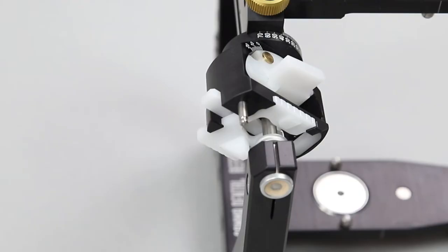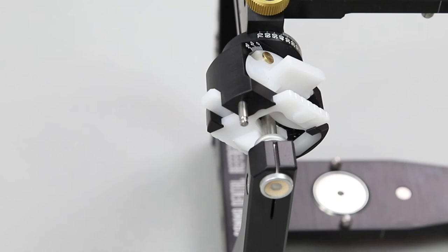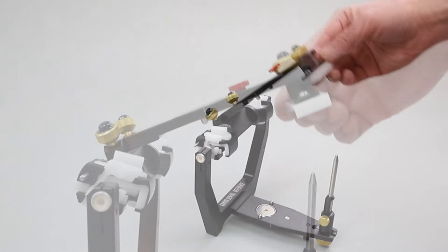The condylar housings are equipped with integrated centric locks. By moving the locks upwards, the lock mechanism is activated and the articulator members are fixed in a firm centric position. In this position, the movement capacity is limited to pure rotation.